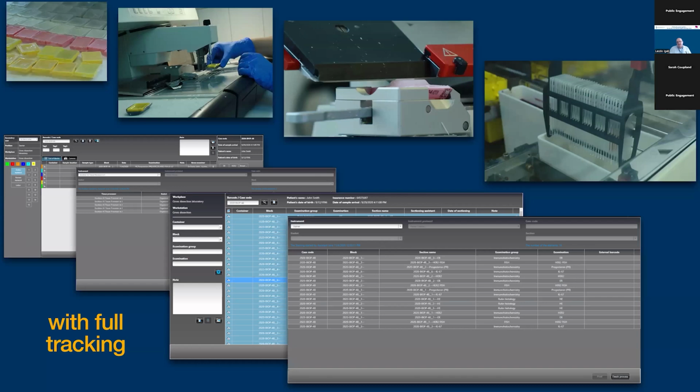In the old days, you had to actually dry the slides to get things through in time for the scanner, which would be scanning the dry slides. Spoiler alert, most of the scanners can do wet slides as well. We can do frozen sections with them as well without creating any damage to the slide scanners. But still, the best way of putting the slides from the stainer cover slipper to the scanner is without touching them. And also you are saving yourself the slide cleaning in the meantime.